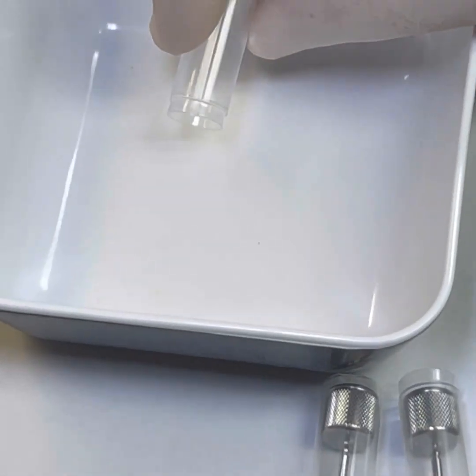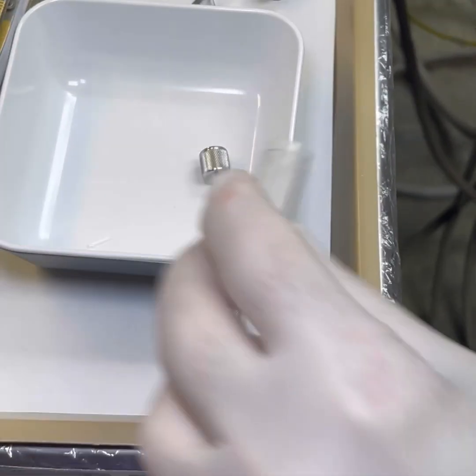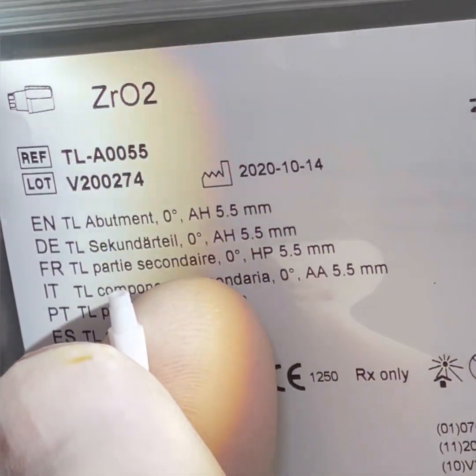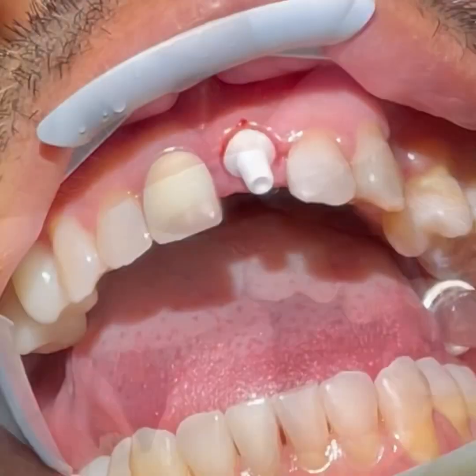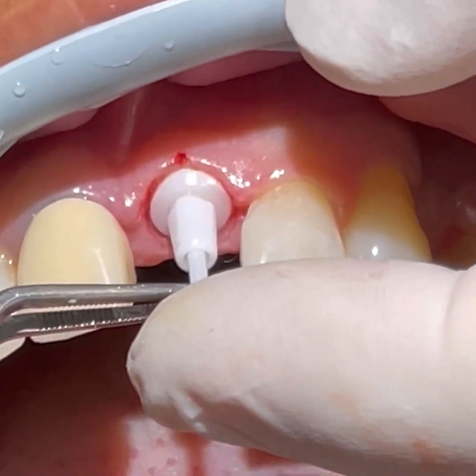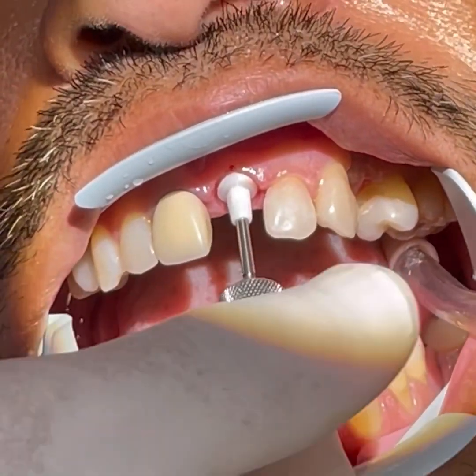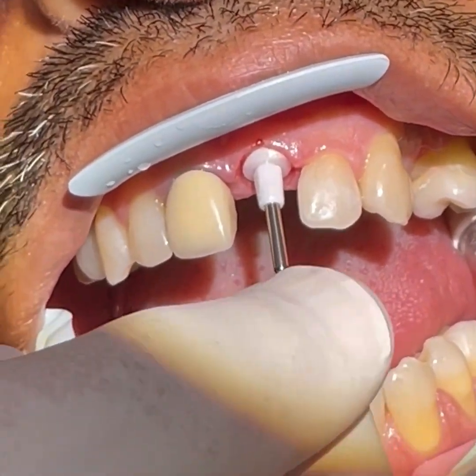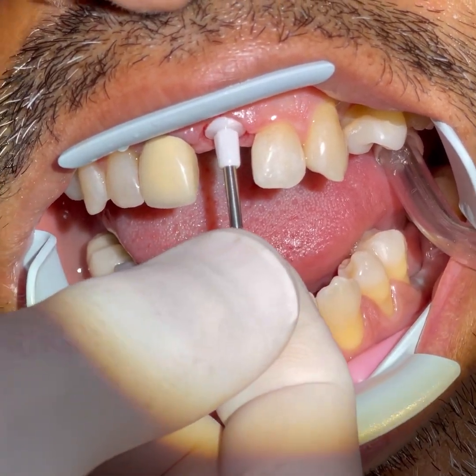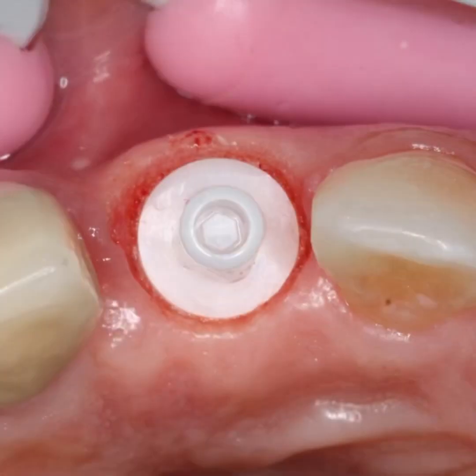These abutments are screwed in with ceramic screws. The driver for these screws is a handheld device which will bend or break when the desired torque is achieved. After disinfection of the internal chamber, the abutment is placed, the screw is inserted gently into the hole, and it is tightened, making sure we exert the forces along the axis. We carefully twist it until the shaft starts bending or breaks.